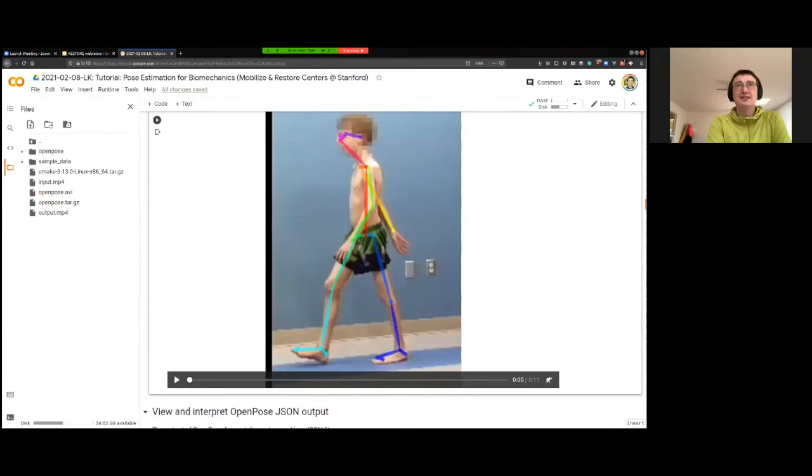OpenPose, of course, works right away for upper extremities. What I showed in the second part of the webinar, you could do exactly the same for upper extremities, because that didn't rely on any data sets. But what I showed earlier in our research work really relied on this data set of 2,000 videos, and I haven't seen a data set like this for upper extremity movements.